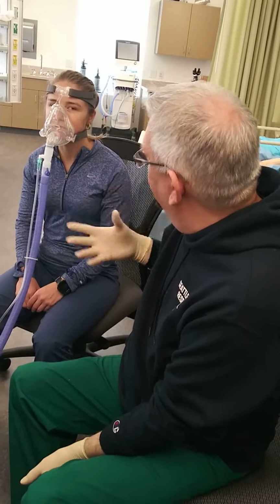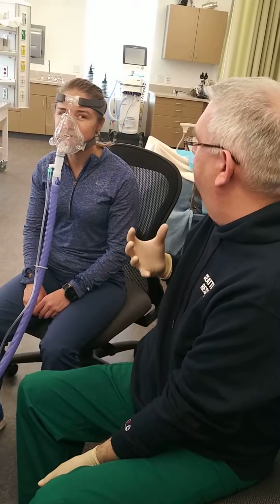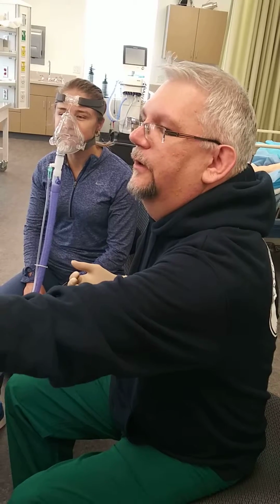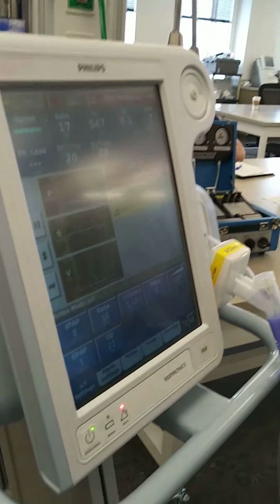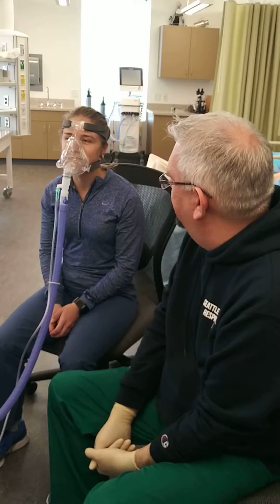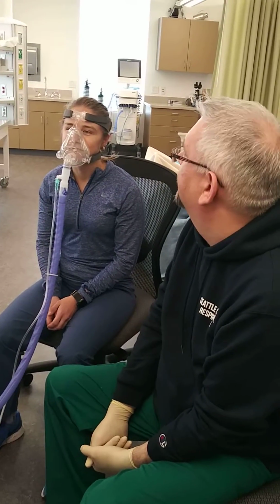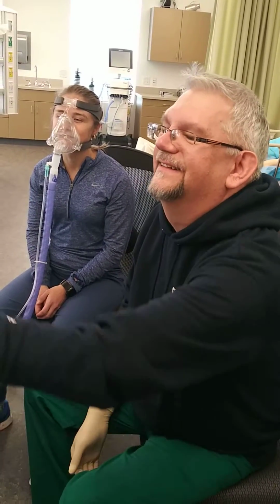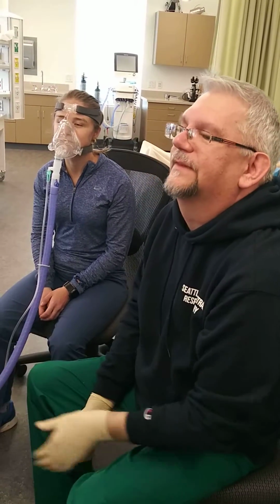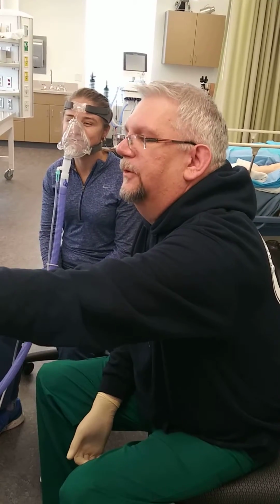So as you feel it's kind of helping you breathe a little bit, I'm going to turn up the pressure a little bit. So you're going to feel a little bit more of a push when you breathe in, okay? So we're going to go up maybe by 2, go from 6/5 to 8/5. Just kind of breathe easy. You don't have to fight it. Just let it help you breathe. Let it help you take a deep breath. Okay. Is it in ST mode? It is, I think. Yep. Okay. Okay. I'll go up a couple more.